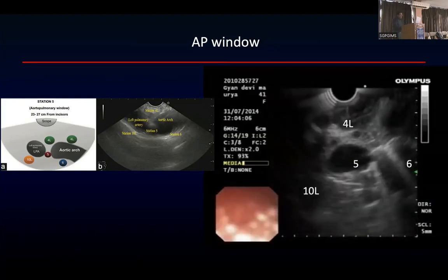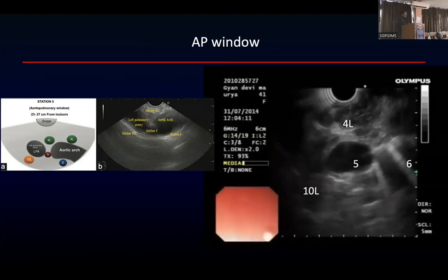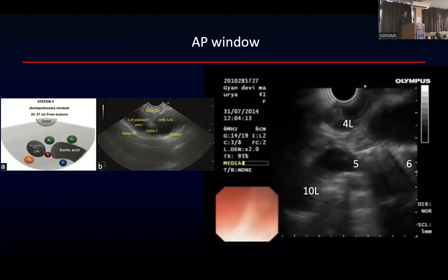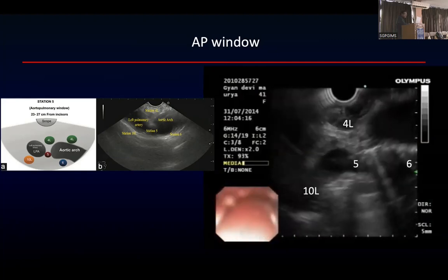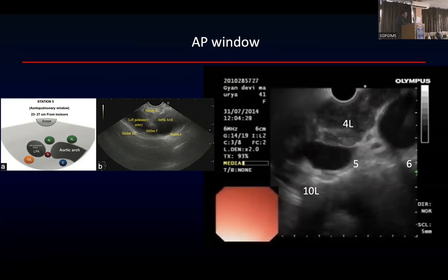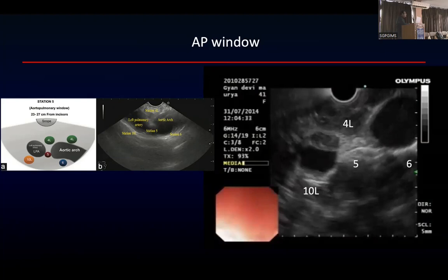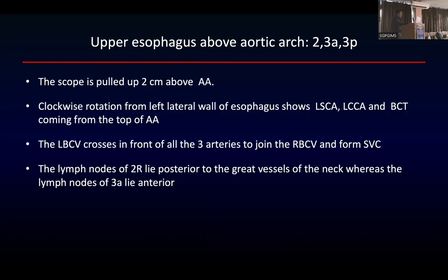So 4L, 5, 10L and 6. I think I've just positioned that where ultimately it will be there in the end. 4L ऊपर है प्रोब के पास, 5 नीचे है, beyond the aortic arch 6 है, ये है। Okay, so this is what you need to know.